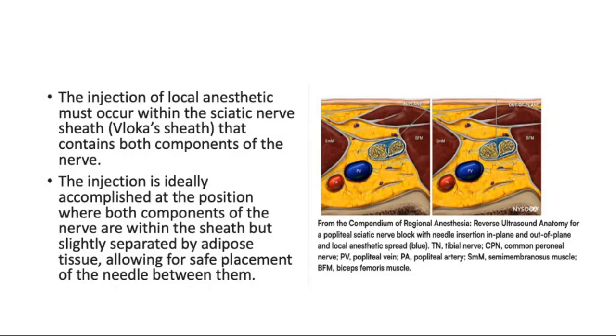Of course, we have the parasacral, but I think parasacral is even a bit too advanced personally for me. So if you have doubt as to where the nerve is, you can just put a probe starting from the popliteal region and then scan up. If you can appreciate that there's a continuous structure, then more likely than not, that is the sciatic nerve. But if you want to scan it up and down, you might have to use a curvilinear probe from the beginning, so that you can trace it from the relatively superficial popliteal region all the way up to the transgluteal region.